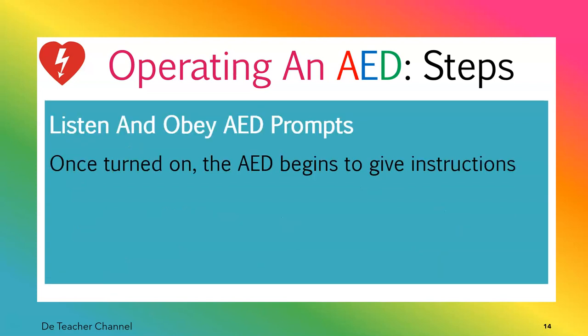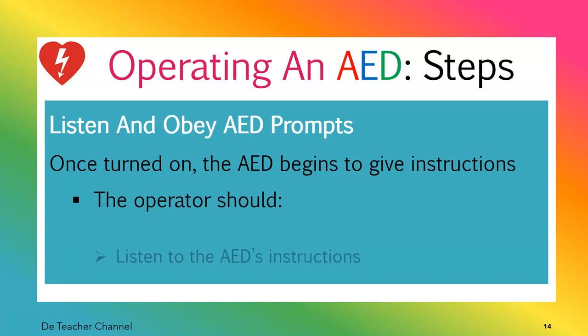Okay. Then once it is turned on, the AED begins to give instructions. So the next thing is listen. Listen attentively to the instructions dished out by the AED. So what is your role here? What is the role of the person using the AED?